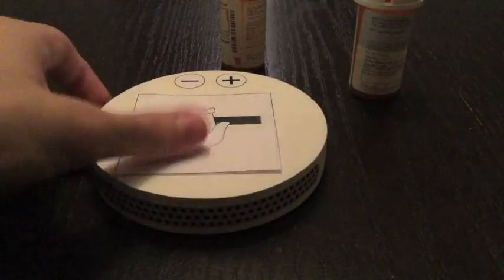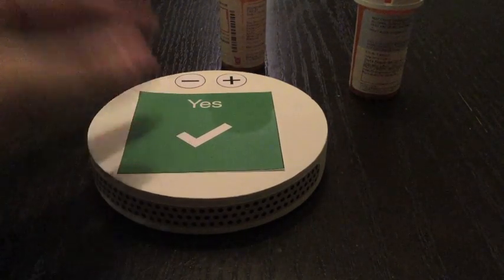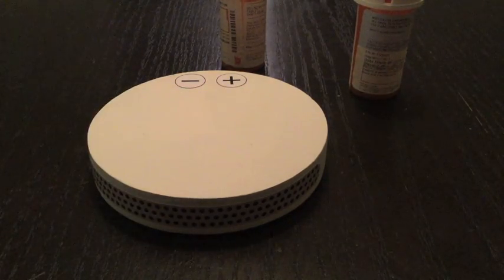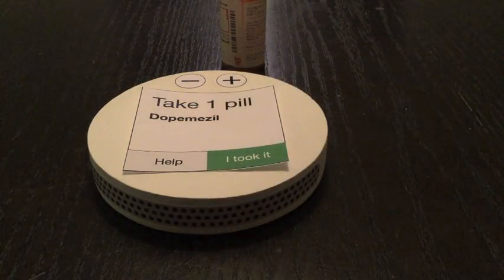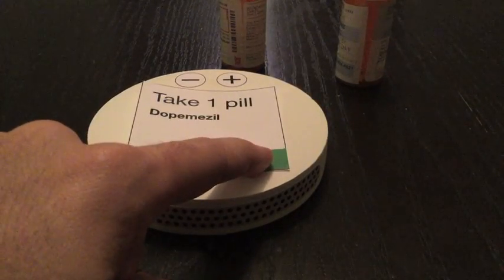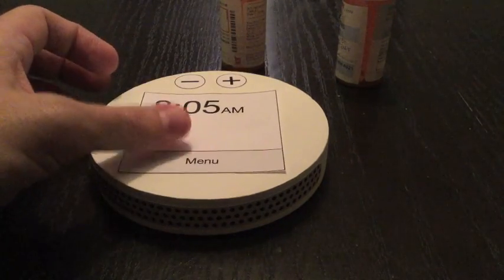They scan another bottle. If that bottle is the correct one, the device tells them that it's correct, and then reminds them of the dosage. They take their medication and then confirm by clicking the I took it button, which takes them back to their main screen.